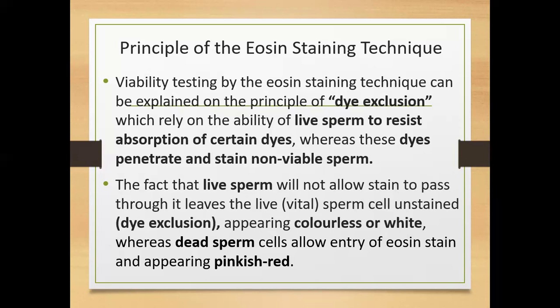So now with this concept of dye exclusion, what it means is that the cells which you saw as dead, in quotes, and which are actually not dead, will not allow the dye in, because you know that the cells also have an intact plasmalemma. What is plasmalemma?